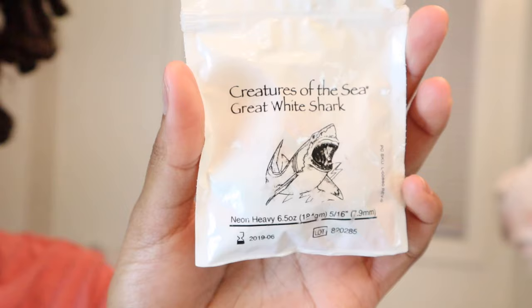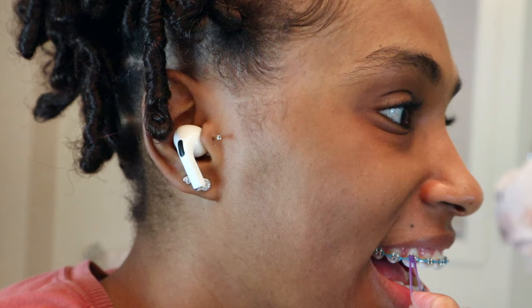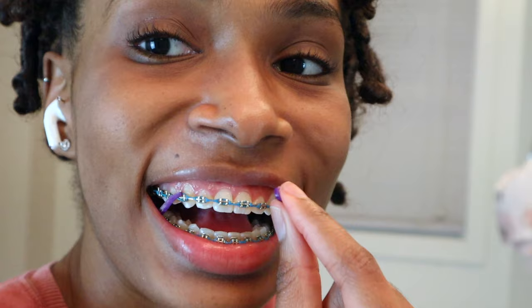Last two things, I swear. I am wearing rubber bands on my teeth, so I'm just going to take them off and show you how cute my rubber bands are — I have pink, purple, green, orange, and they're all neon colors. I'm just about to put those back on, and then I'm going to moisturize my lips, and that will complete my braces brushing routine.